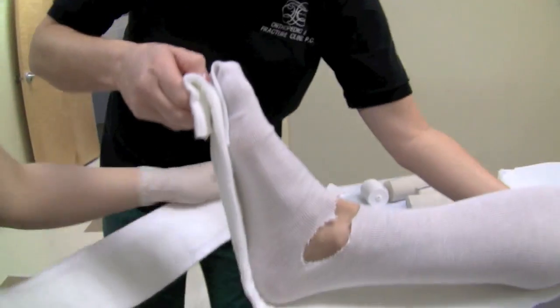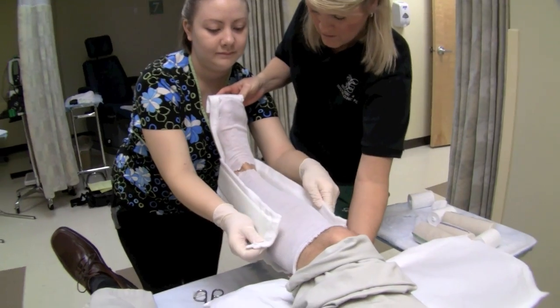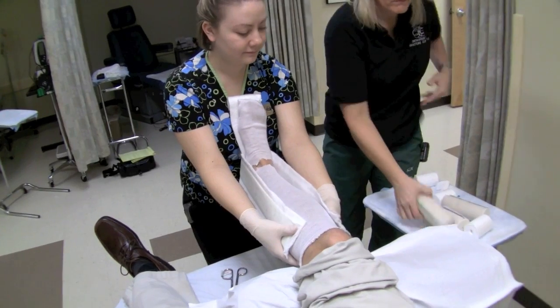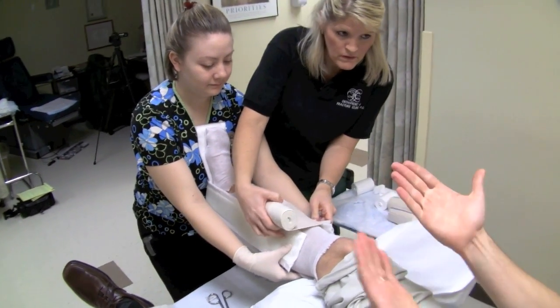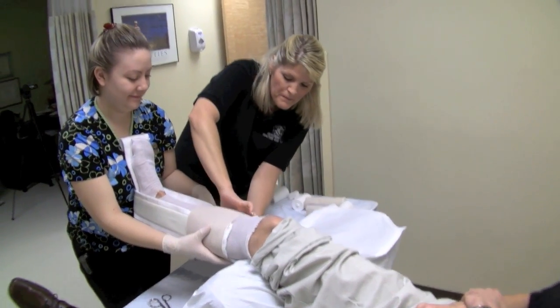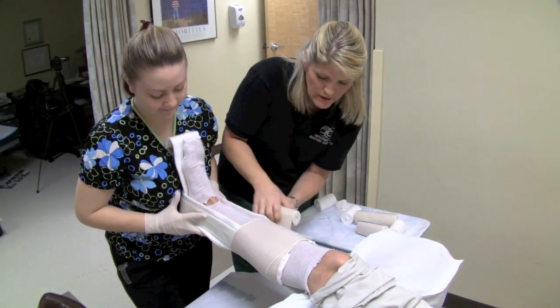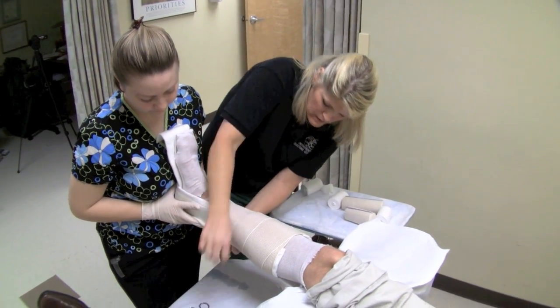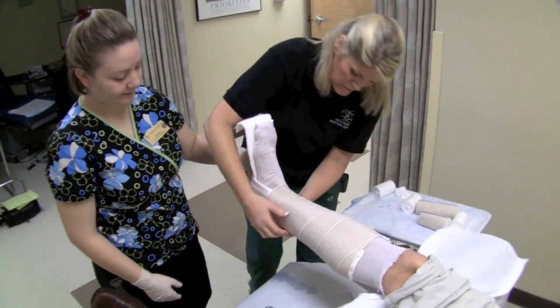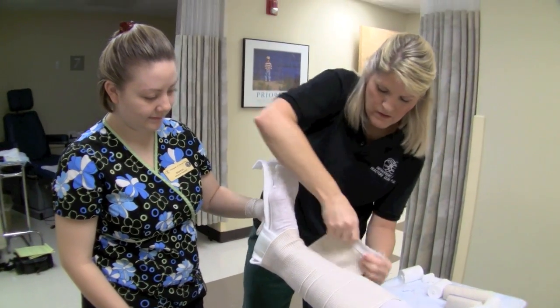Now applying the stirrup (U piece), with the end right at the tip of the toes. The stirrup comes up just to the top of the calf. Pressure is applied to hold the foot at 90 degrees. The wrap goes on snug but not too tight — rolling it on, not pulling. You can feel the stirrup putting pressure on the heel and ball of the foot.